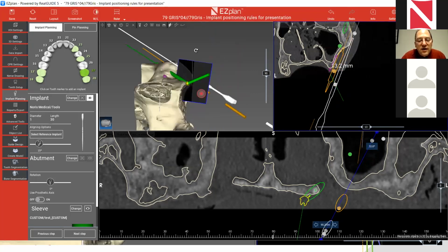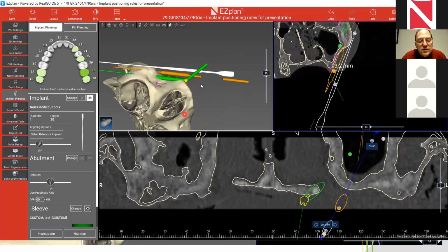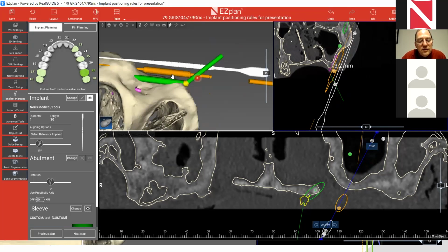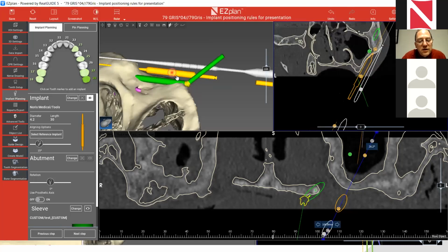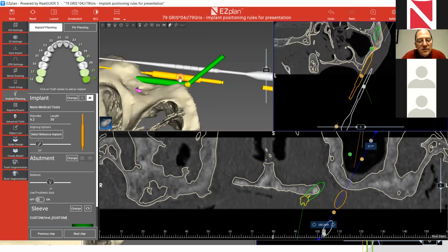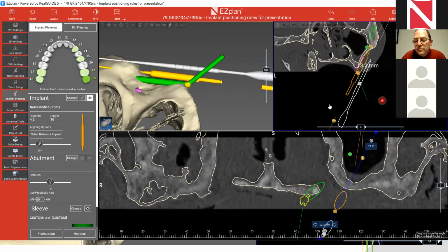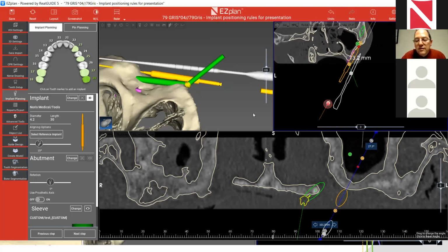When I take it down, I do it this way. I am in the right angle, and I just go back like this. This would be my entering position right now. Maybe here, like that. And I will change the angle a little bit more, like that.